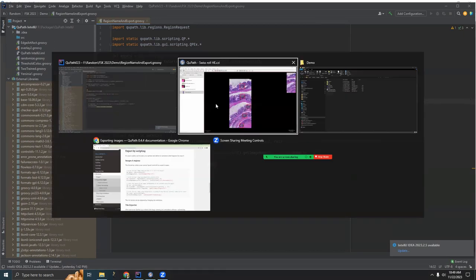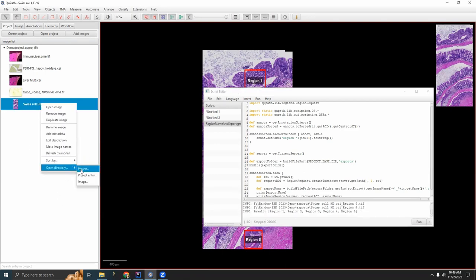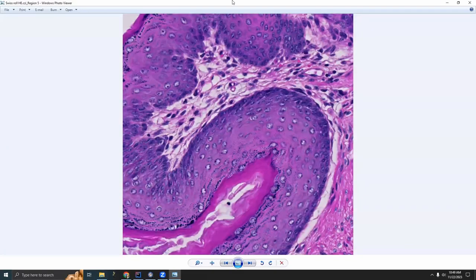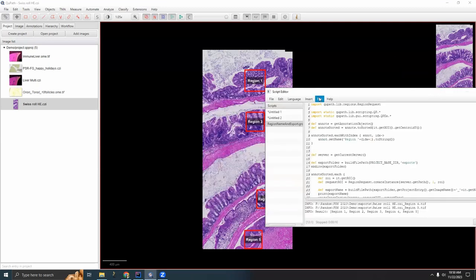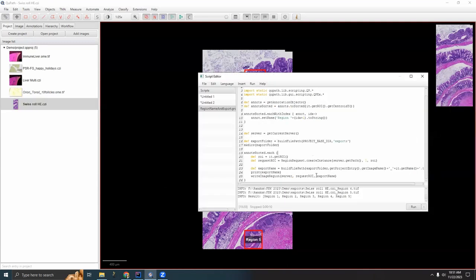Okay, let's see what happens. Control R for run. And okay, that looks correct. And then let's open the project folder. Oh, export folder exists. Images exist. It actually did the thing. I only have one image here that's relevant to this particular script, but you could easily go run for project and select anything you want. And then run this, and it should work for all images, and it shouldn't overwrite any data because we've included the whole image name in the export name.